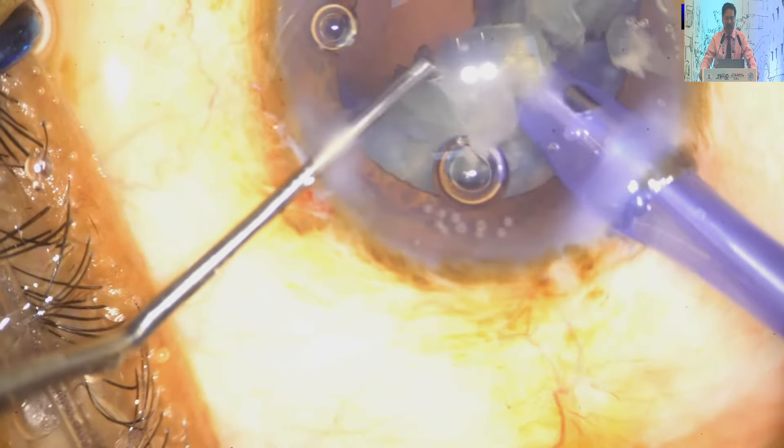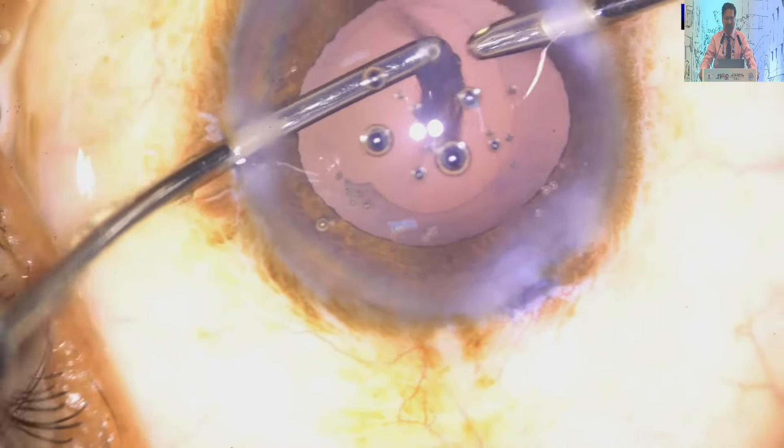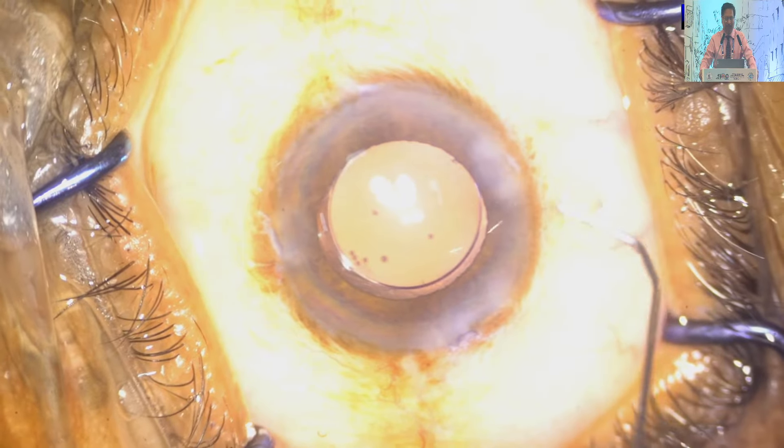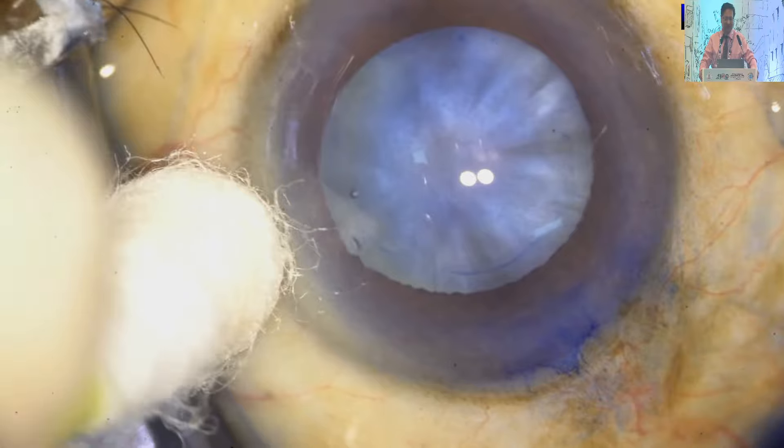Many times you encounter a hard nucleus, and sometimes a soft nucleus in intumescent cataract. In young people, most of the time it is a soft cataract. This is another case.